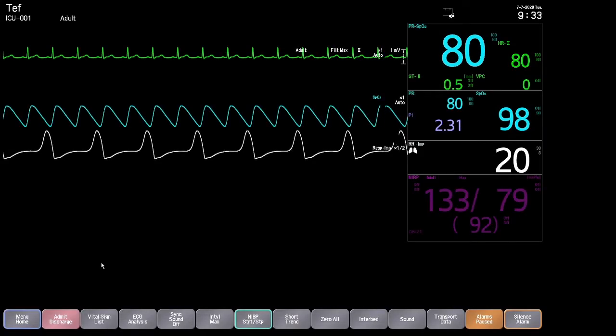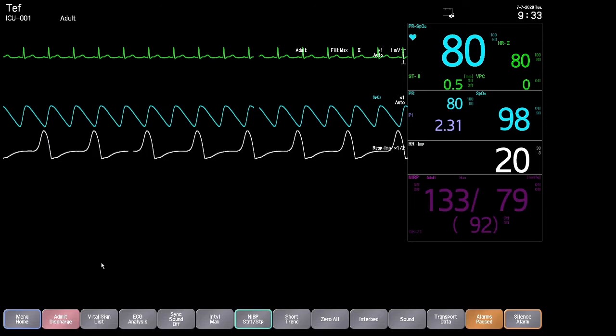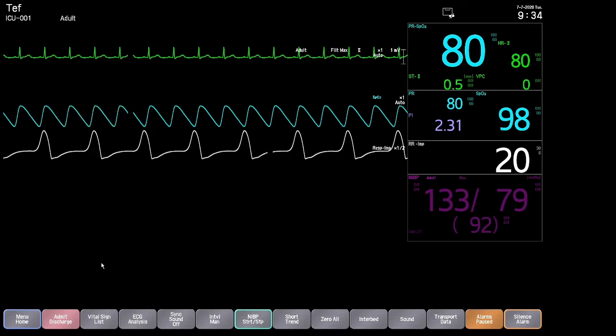In this video, we will demonstrate basic SpO2 monitoring. This will include the SpO2 cable, SpO2 settings, and SpO2 alarm settings. The SpO2 monitoring technology will continue to be the Masimo technology. The same oxygen saturation probes will be used.